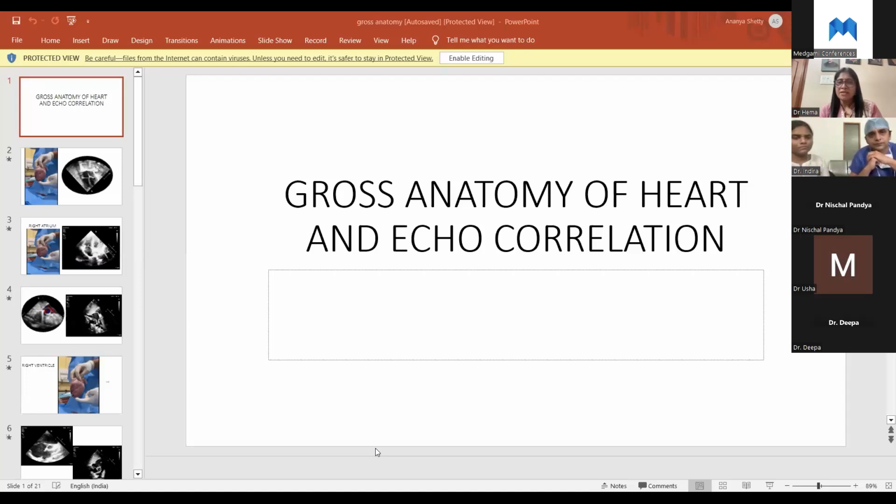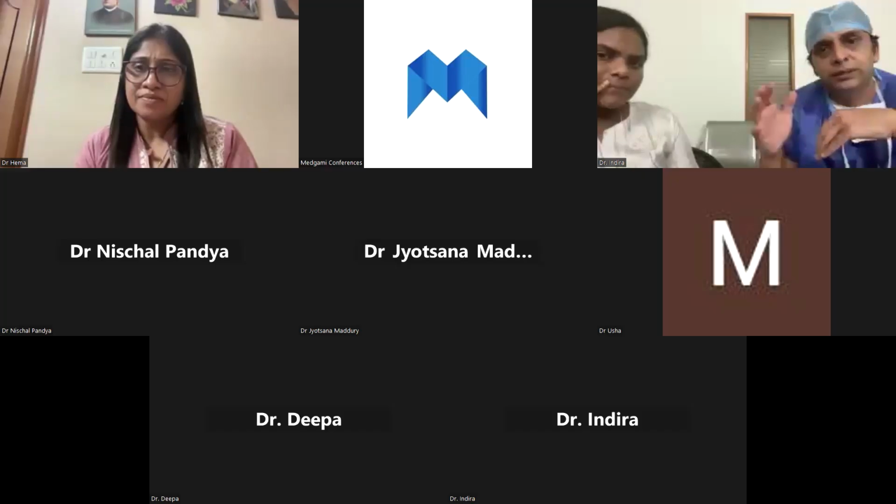Have you had surprises when you thought the ASD was much smaller, and when you opened up you saw the ASD widen up in some different three-dimensional view during the surgery? And which rim do you think is very important for us when we try to go ahead with device closure for such patients? So in ASDs, whatever we see on an echo, that 2D picture, in my mind it'll always be 1.5 times bigger than that.